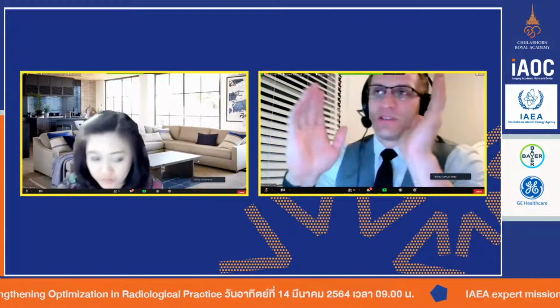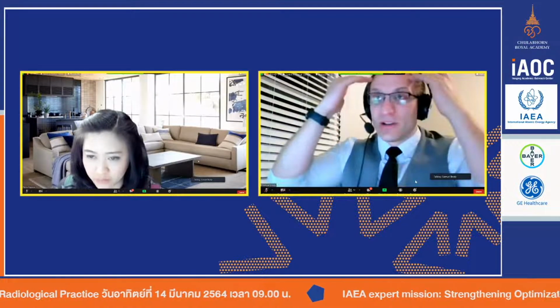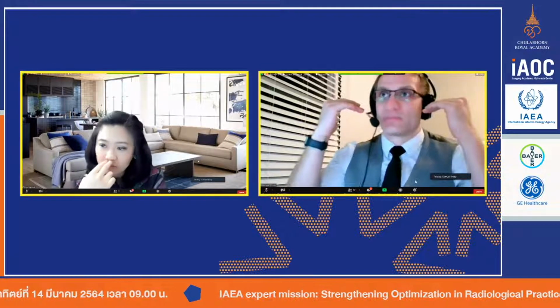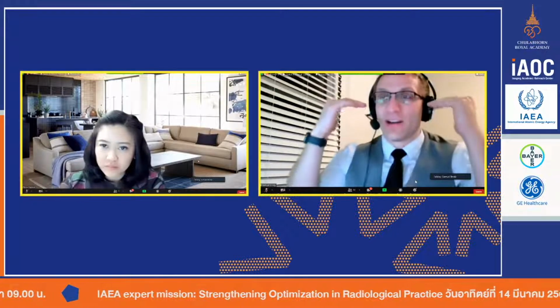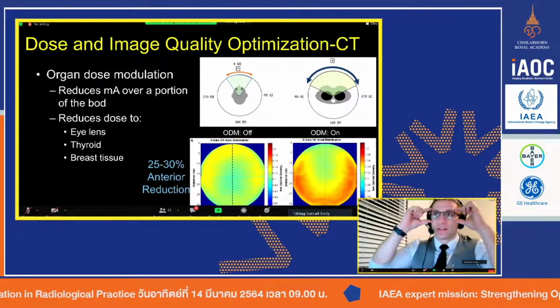So right now, if you have organ dose modulation set up, you place the patient on the scanner. You're going to do the planar radiograph, or the scout, or the tomograph, or they all have their names. We'll just call it scout for now. And when they do that, you have the scout image on, and you'll set your scan field of view. And there will be a second box that you just put over the eyes.